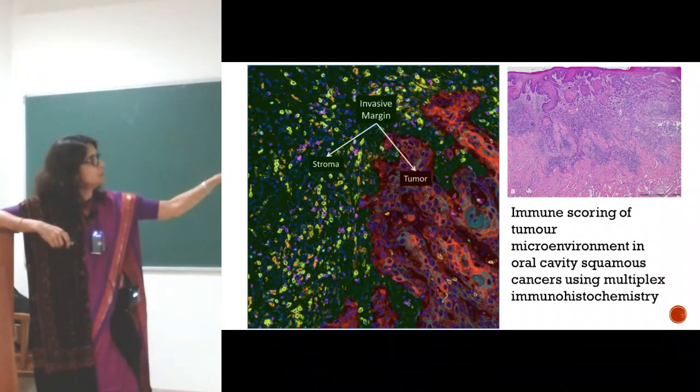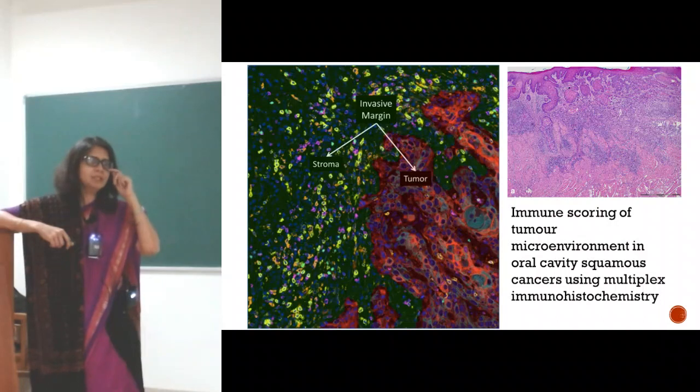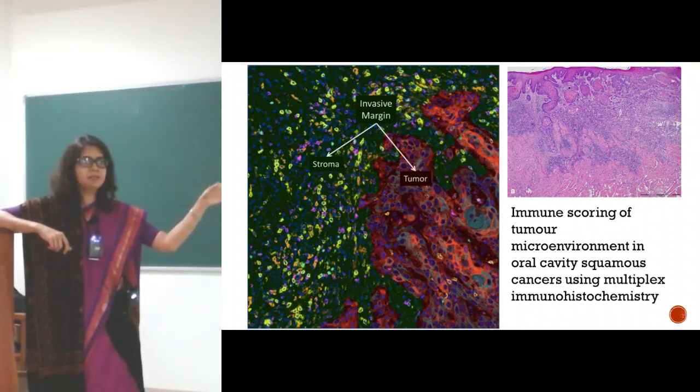In the stroma, there is a dense lymphoid background. There are a lot of lymphocytes. Now this background is very different in different patients, and currently in our understanding, patients with dense lymphoid background do better than the patients without, and they can actually get a different targeted treatment.